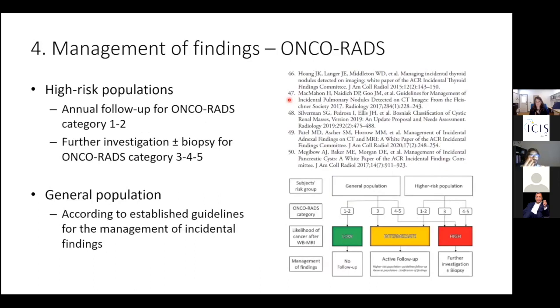I added a fourth point in this brief discussion that we have. We also discussed the management of findings, because if we find something, there's an issue, how to manage this.